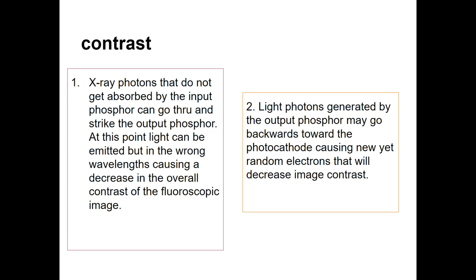But honestly, with the fluoroscopic images that we utilize, the power is not really one image per se. The power is being able to see the flow. I was actually talking about this yesterday, related to something different, but if you had a heart valve, a heart valve looks like a circle, and then you have blood flow. But if you look at it like this, is the blood flow going from ceiling to floor or floor to ceiling? Why? How do you know?